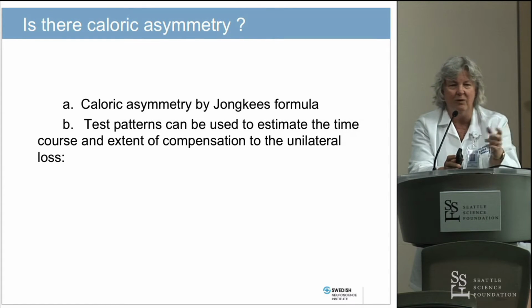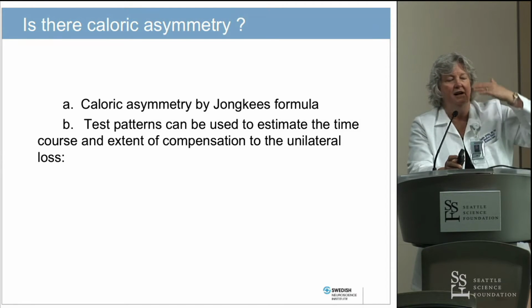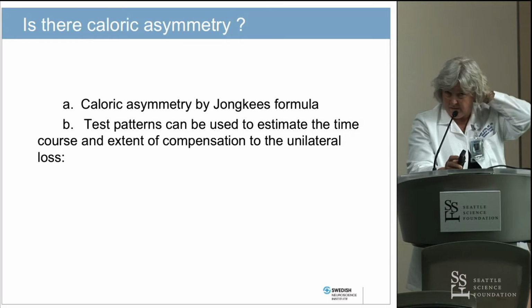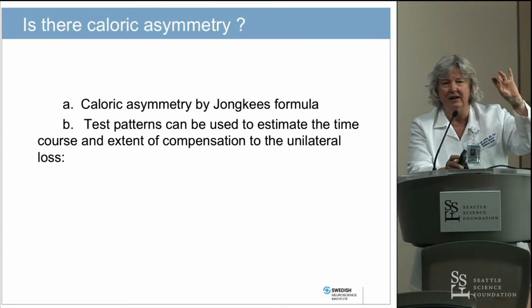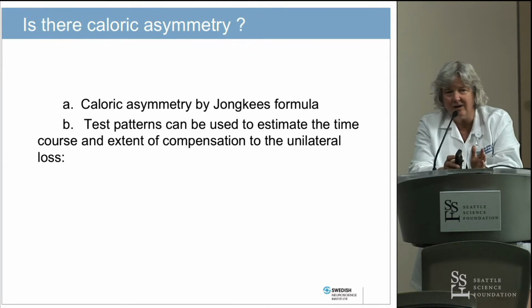That's why they do that thing where they say, name things that are green, girls' names. They're trying to get the patient into this groove of alert wakefulness, concentration, not too sleepy, not too jittery, because it affects the waveform of the nystagmus. So think of all these factors: wax, anatomy, technical issues, technician issues, and lastly, the level of brain function. Calorics is an extremely variable, terrible test.